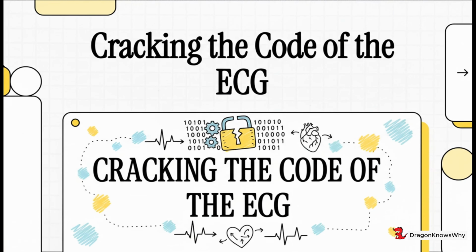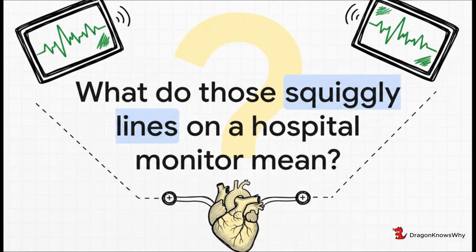All right, today we're cracking the code of one of the most common, yet, let's be honest, often misunderstood tools in all of medicine, the ECG. Yep, you've seen them a million times in movies and on TV, right? Those beeping, squiggly lines on a hospital monitor. But have you ever stopped to wonder what story they're actually telling? Well, let's decode it together.